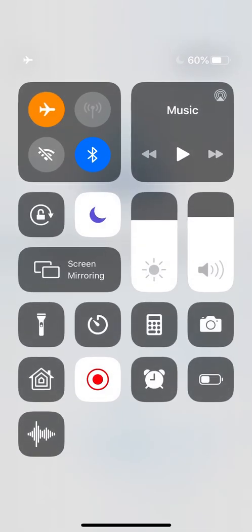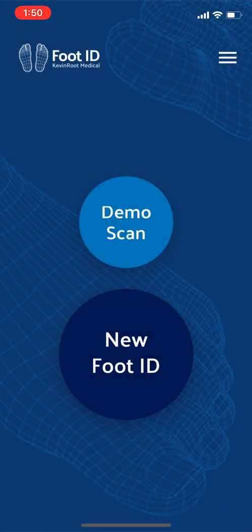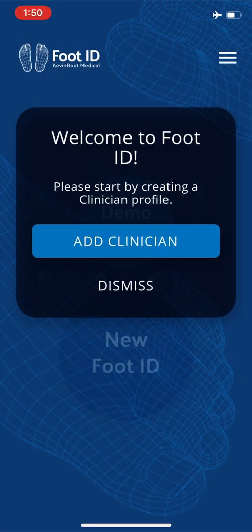It's probably because I'm on airplane mode. Let's click airplane off and sign up — and there we go. I'm going to put it back on airplane mode so no one bothers me. Welcome to FootID — please start by creating a clinician profile.